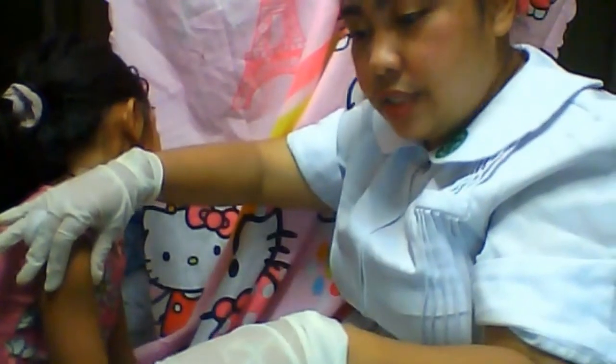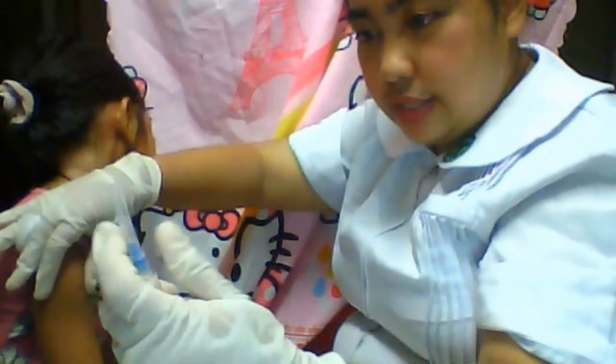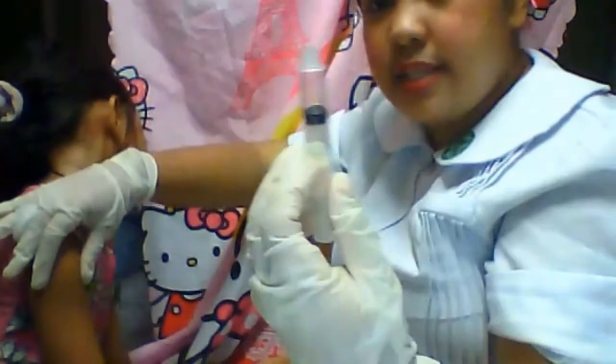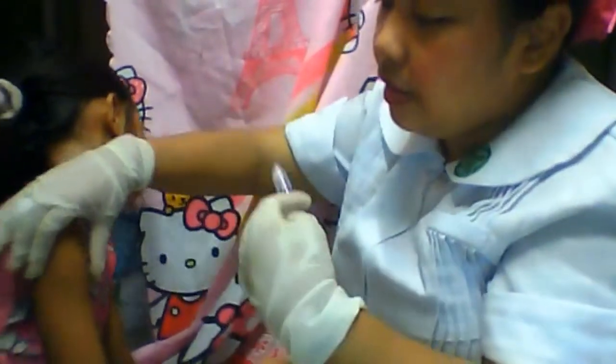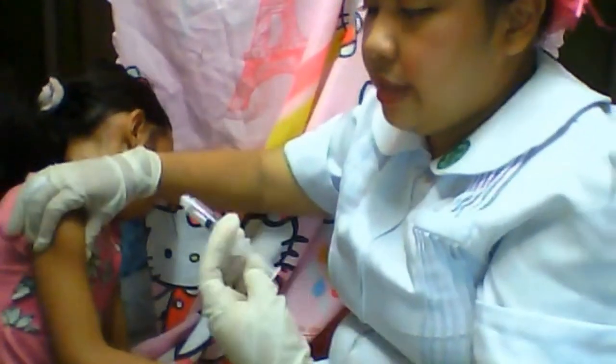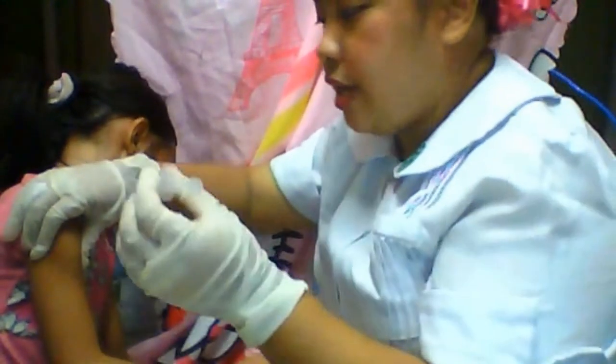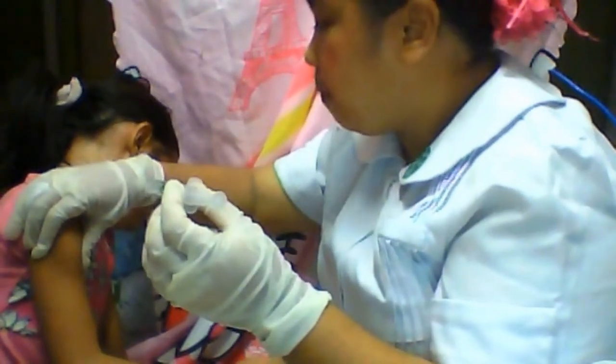For safety purposes, I will not be using the syringe with a needle. I will use this one instead. You pinch this area. Alright, ma'am, I will be injecting. This will just be really quick. You will feel a little discomfort, but tolerable.